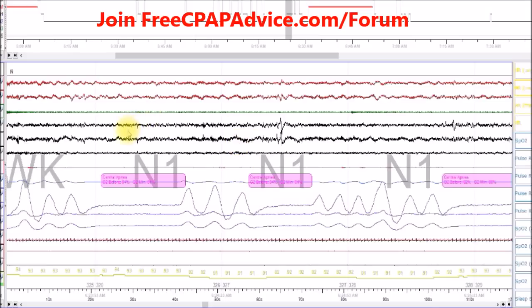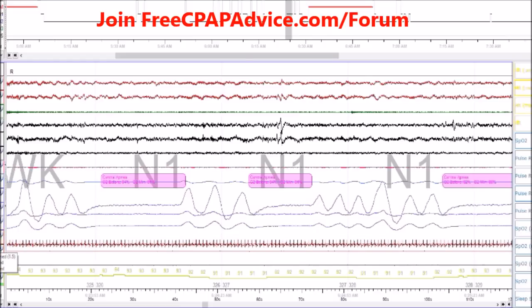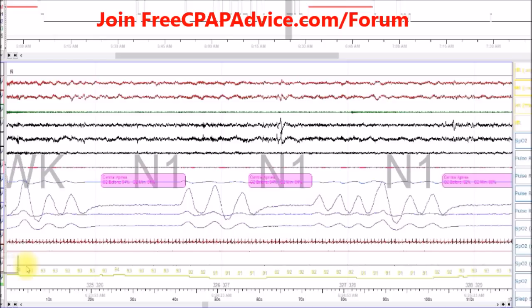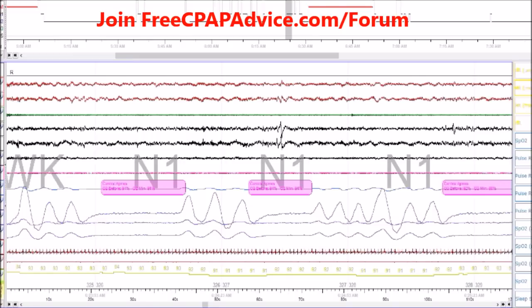So you can see the EEG. Now this is a two-minute window, so it's going to be hard to actually see it. We have the snoring. We have the P flow, which is a nasal cannula that gets pressure. The chest and abdominal belts. Then we have the EKG — you can see actual heart rhythm, every beat there. And then we have the SpO2 and legs, though the legs actually were not used for this study, so I'm going to remove them.